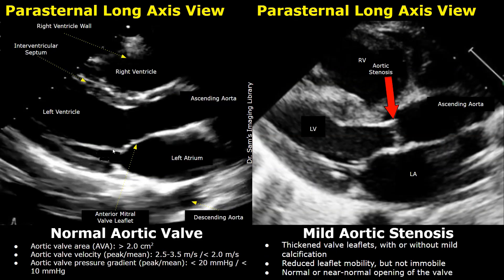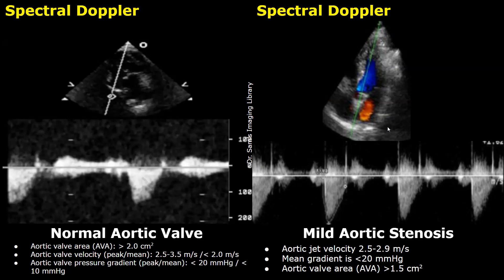In mild aortic stenosis, you may see either a normal aortic valve or thickened, calcified hyperechoic valve leaflets on echocardiography. In real-time imaging, the valves may move slower than normal. Spectral Doppler is very useful in classifying aortic stenosis into mild, moderate, and severe. The main spectral Doppler parameters to note are aortic jet velocity, mean gradient, and aortic valve area. In mild stenosis, the jet velocity is between 2.5 and 2.9 m/s, the mean gradient is less than 20 mmHg, and the aortic valve area is greater than 1.5 cm².